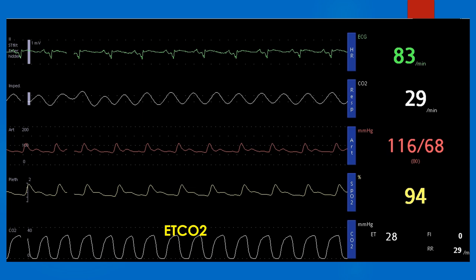In the monitor screenshot, the capnogram is seen at the bottom. Here the ETCO2 is shown as 28 mmHg. It is below the lower limit and could be due to hyperventilation in a spontaneously breathing person. Respiratory rate drawn from capnography is 29 per minute, which matches with the respiratory rate measured by transthoracic impedance monitoring in the second tracing from the top.